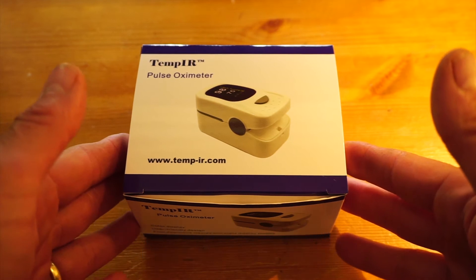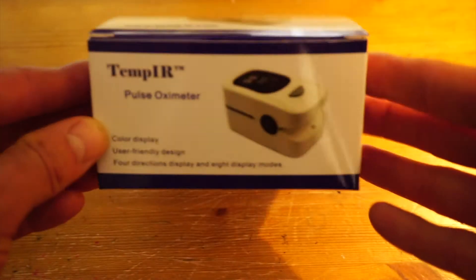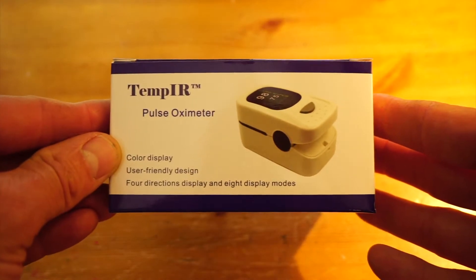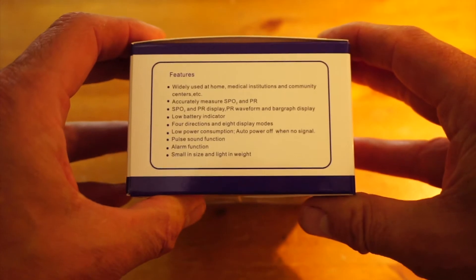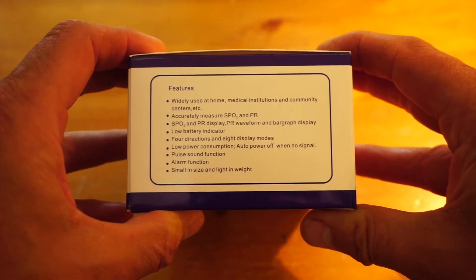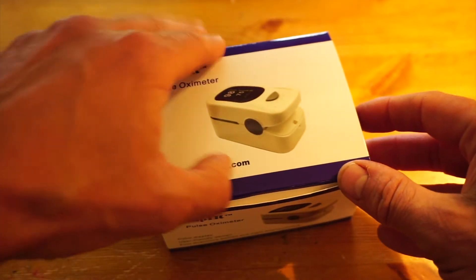Hello, this is Tristan from Cardiocritic.com and this is a short video review of the TempIR pulse oximeter. We will start the review by unpackaging the device as it is received and then show you how simple it is to use this pulse oximeter.